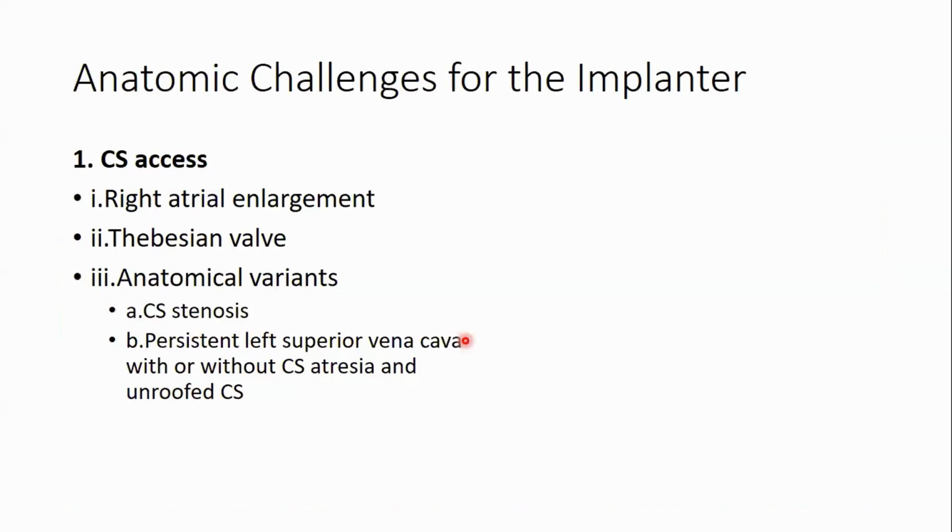And so the cannulation of the coronary sinus is usually done in an LAO view. And the reason we do it in an LAO view is that once it crosses the midline or the spine and goes towards the right side of the screen, then we know confidently that we are in the coronary sinus. And at that point, then we can take our venogram.